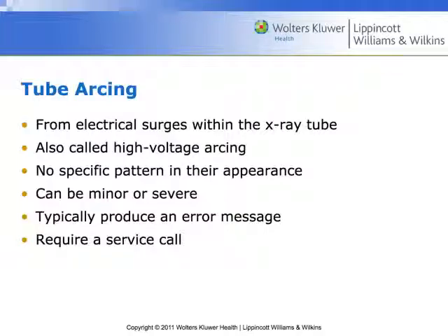These can be very minor, or they can be very severe. Typically, it's going to produce an error message. It might even shut down the machine. It may require some kind of service call, or eventually the replacement of that tube.